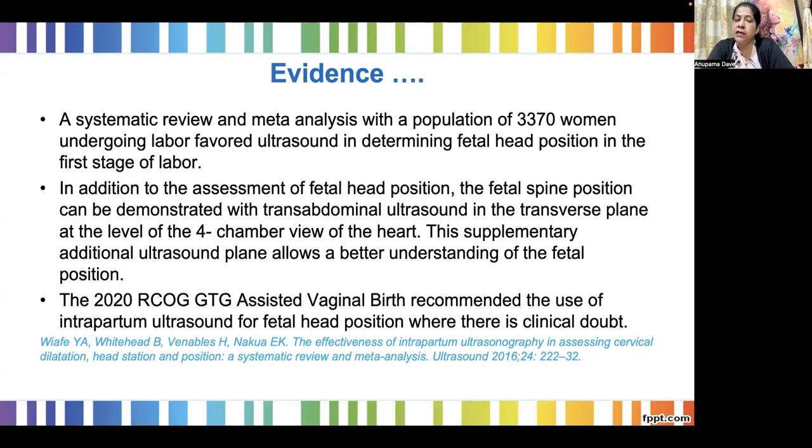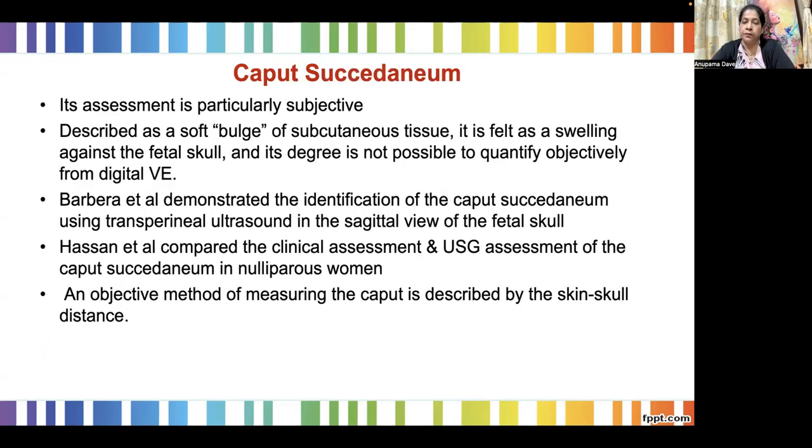In the recent Green Top guideline by RCOG on assisted vaginal birth, they have recommended the use of intrapartum ultrasound for fetal head position whenever there is a clinical doubt. Now let us see how it helps in identifying Caput Succedaneum. This assessment of Caput Succedaneum is particularly subjective.